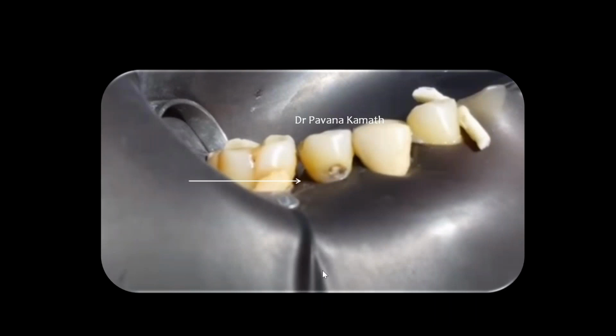And can you note this? The wingless clamp over here, I have put in this image a little in advance. Now, wingless clamps are a great combination when you're using it for multi-teeth isolation for restorative procedures, because they give you a lot of space to work around. Can you see? This is the tooth which is isolated, and see this embrasure, there's so much space for you to work. Now, why do I need the embrasure space?